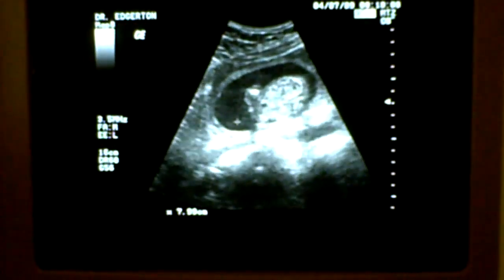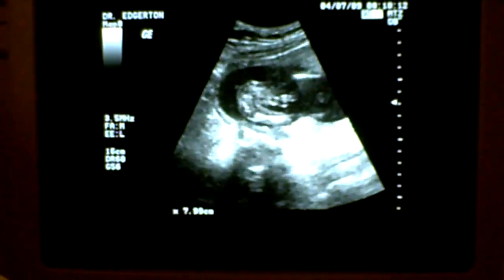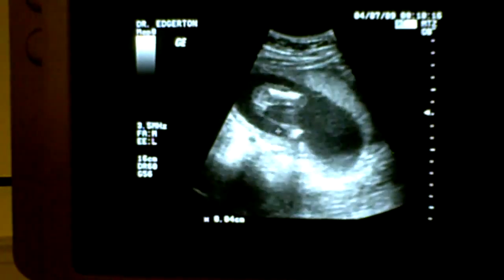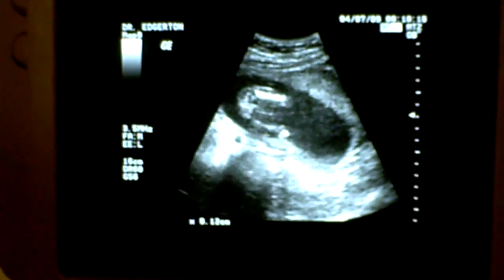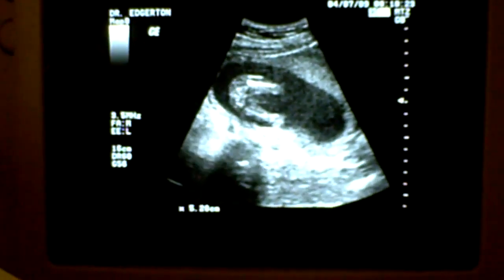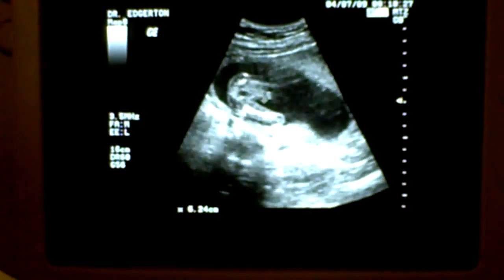Now we'll try to twist the ultrasound a little bit to try to see what we can see between these legs. This is a leg here, this is the bottom coming around here, and this is another leg here, so we're looking right in this area.